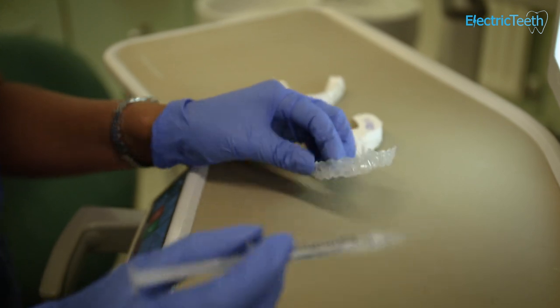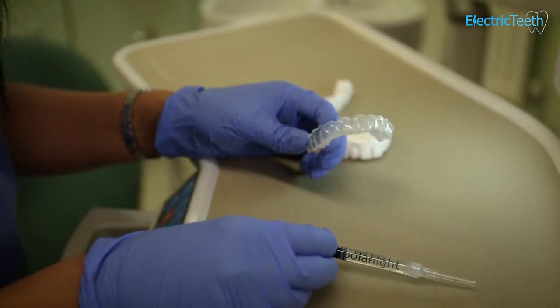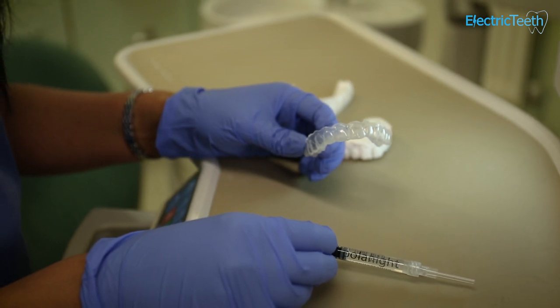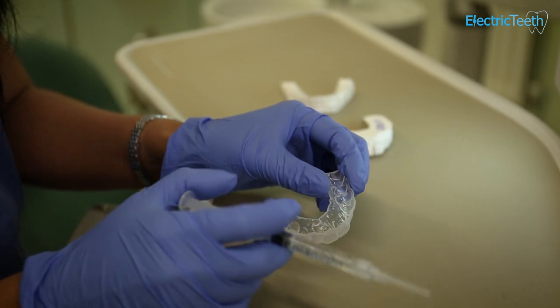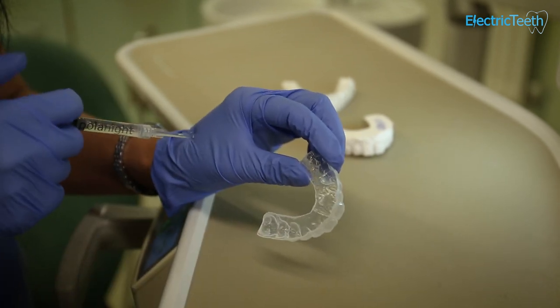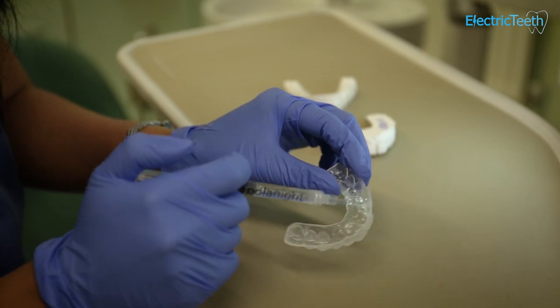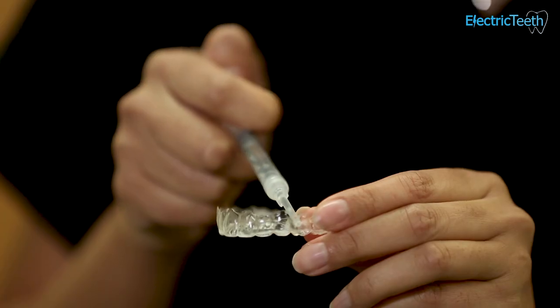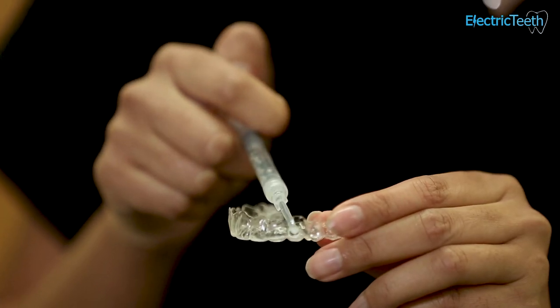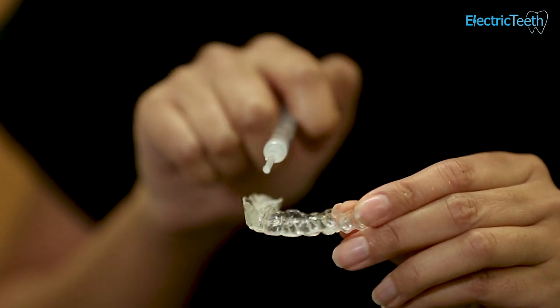Something like Polonite is a nighttime tray-wearing system. At nighttime you would brush and floss your teeth as you normally would. Then you would place a small little dot of the gel inside each little compartment of the teeth. There's not lots — you don't fill each tooth up to the maximum. You literally do one little quarter-of-a-pea-sized dot on each tooth.